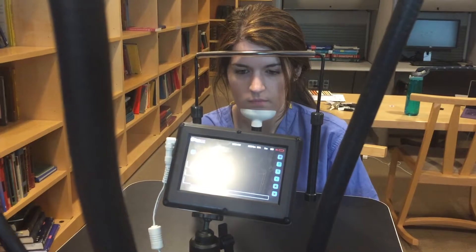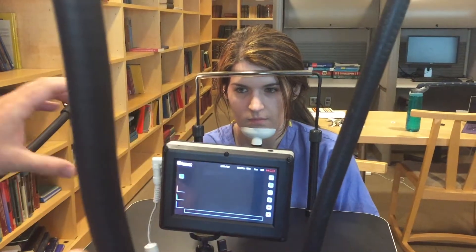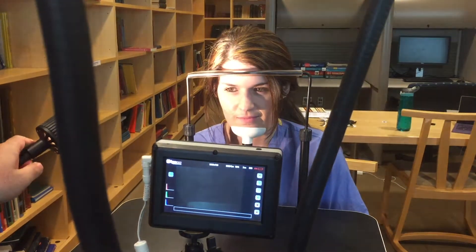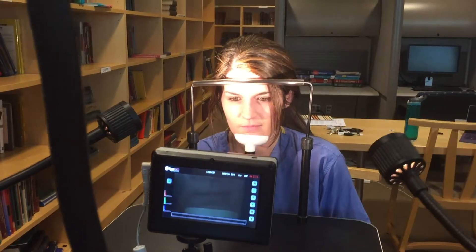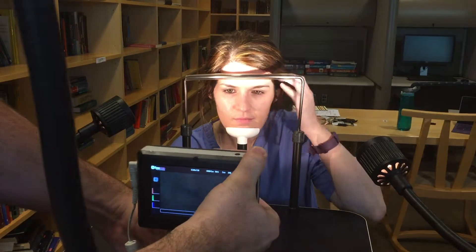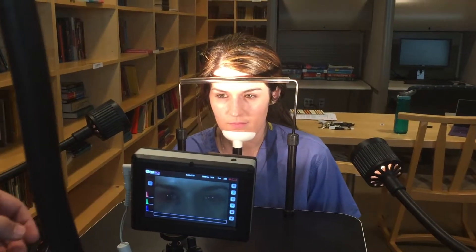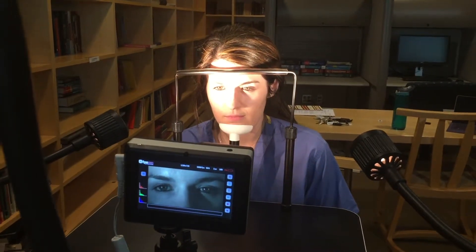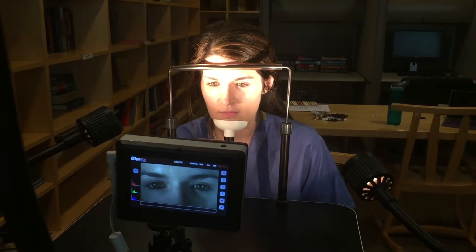The camera doesn't show much until you actually get light on the subject. I'm pointing it at her face now, but you really can't see much until you get the lights on — and then you can see that it actually shows up in the camera. I'll get it on our eyes, which is what we want to focus on. The camera itself has a very narrow depth of focus, so we're going to get lots of light on there and we're trying to avoid casting too many shadows.